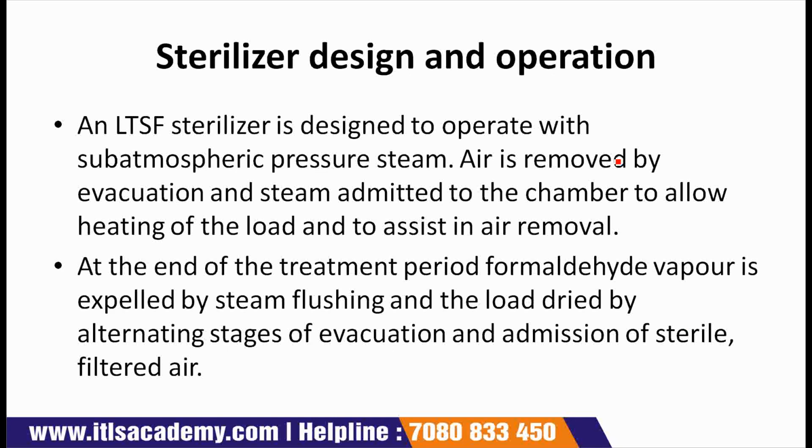Here comes sterilizer design and operations. First point, an LTSF sterilizer is designed to operate with subatmospheric pressure steam.